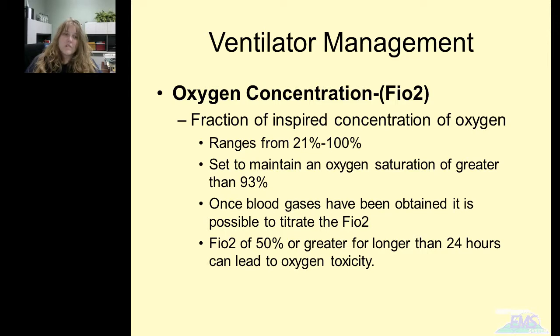Then the final thing that they have is the fraction of inspired O2. So this is the concentration of oxygen that's coming in with each breath. We know that sitting here, me talking constantly to you right now, I'm bringing in the 21% of oxygen that's in the atmospheric pressures around me. But when you're dealing with a patient in the back of the ambulance, we have a little bit of flexibility with that. We could give them up to 100% of oxygen.